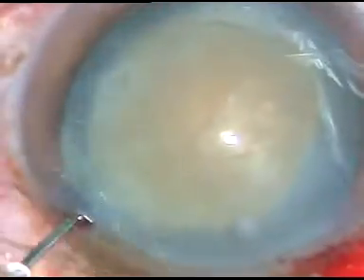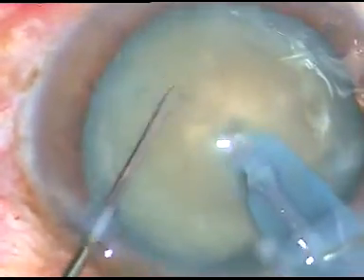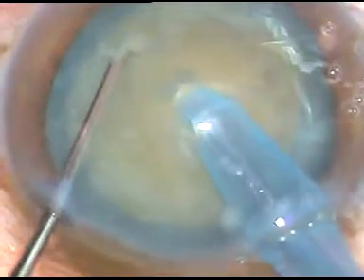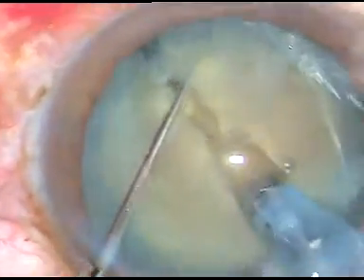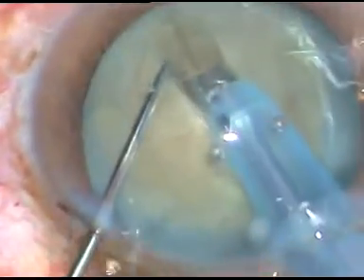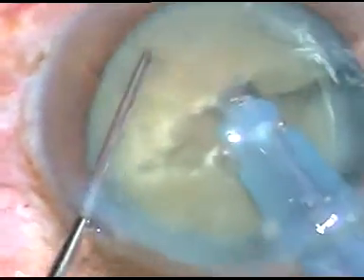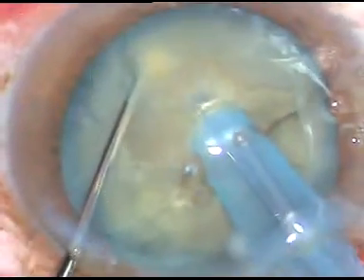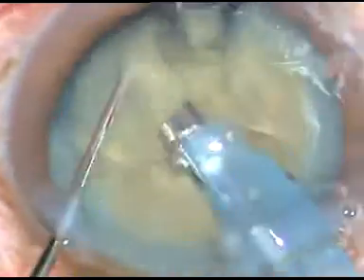The machine has an easy tip. Now what I do is I impale the nucleus with the phaco tip, go almost near the other equator, and then try to separate the nucleus into two halves. I have rotated it 180 degrees. Yes — I have been able to separate the nucleus into two halves, and each hemi-nucleus is again chopped, emulsified, and removed.